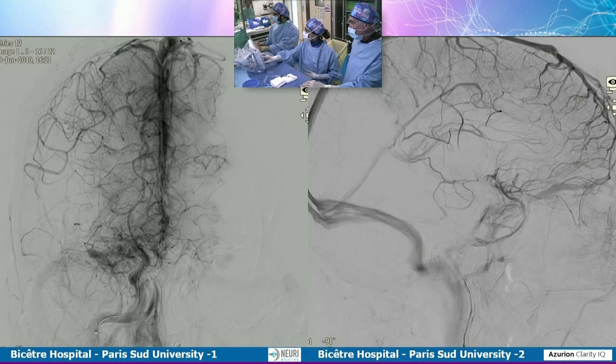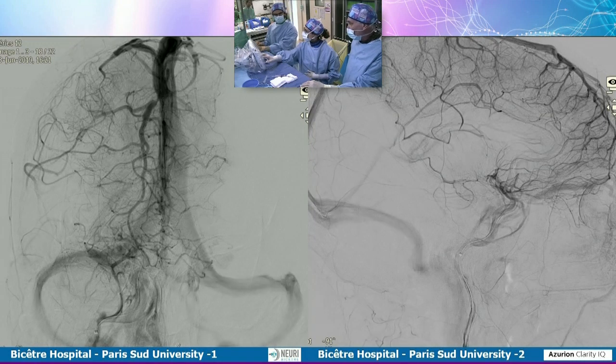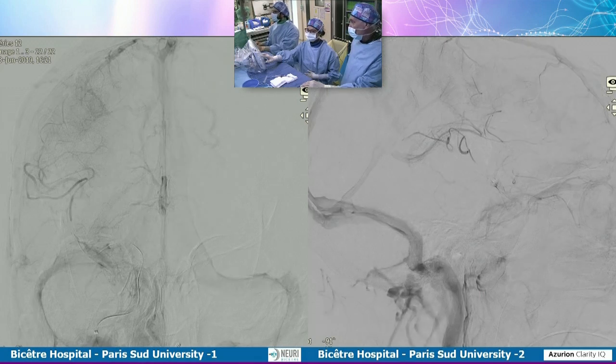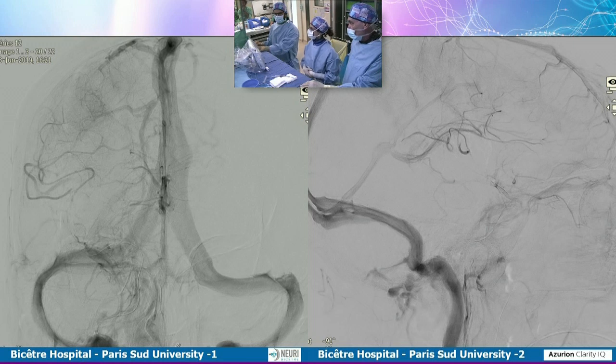We come back, and you can see that the posterior frontal, pre-Rolandic, and parietal area has a good pial circulation and retrograde flow, indicating that you can cover this Rolandic and parietal branch because of the collateral circulation, which is definitely much easier for us because going in the lower branch is easier than going in the upper one with a flow diverter.